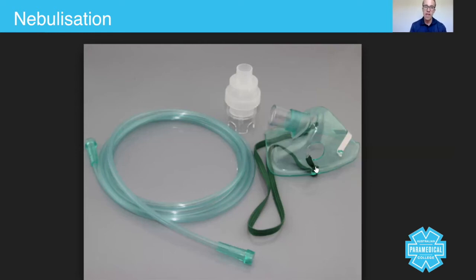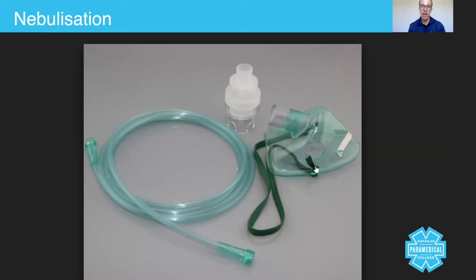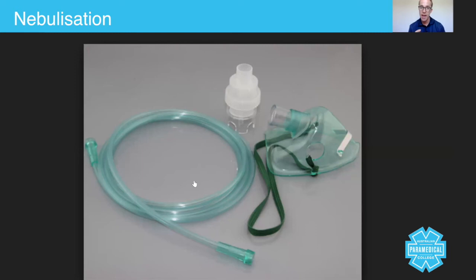Over the years we've started to move away from giving oxygen to COPD patients even with nebulization, and we've now started to attach this device to canisters of air, because remember — with COPD patients, high levels of oxygen can instigate what's called the hypoxic drive theory.